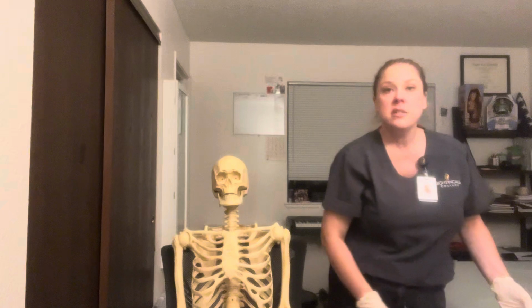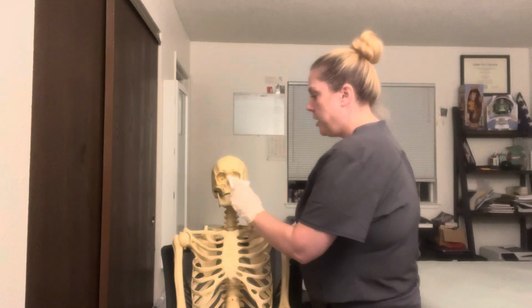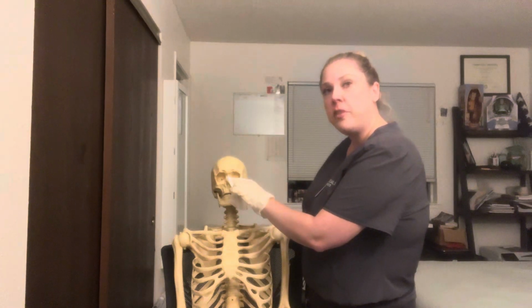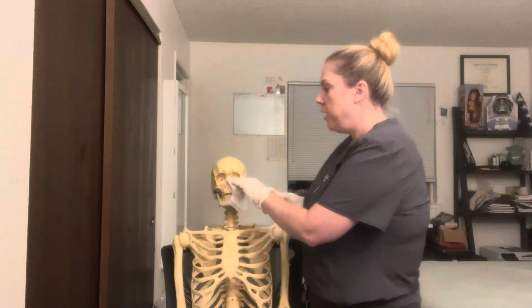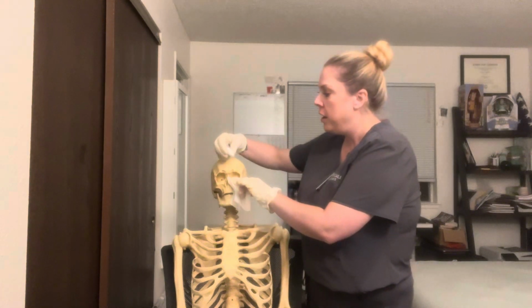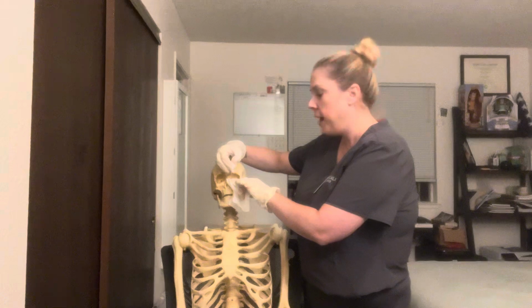Now, with my non-dominant hand, I'm going to have a tissue here. We're going to go ahead and put pressure on the patient's cheekbone with that tissue. I'm going to put my forefinger on the orbital bone here, on the bony orbit, and pull down to expose the conjunctival sac. And with my dominant hand, I'm going to go ahead and have the eye drop ready to go. I'm going to have my hand resting on his forehead, 1 to 2 centimeters from that conjunctival sac.